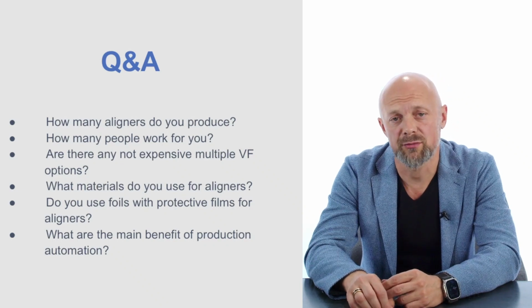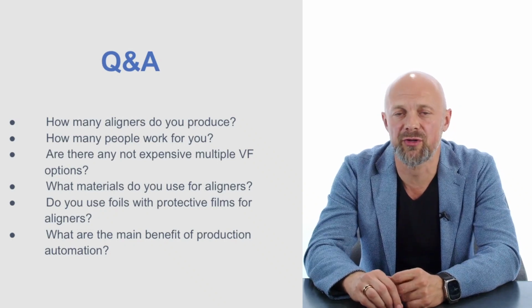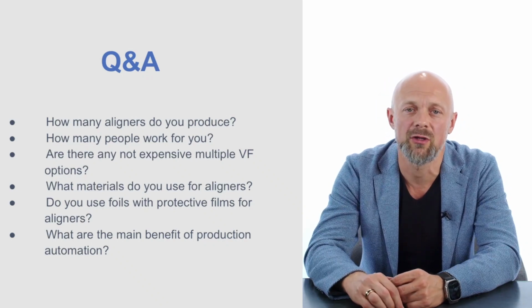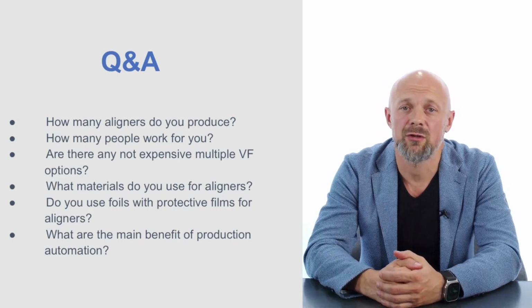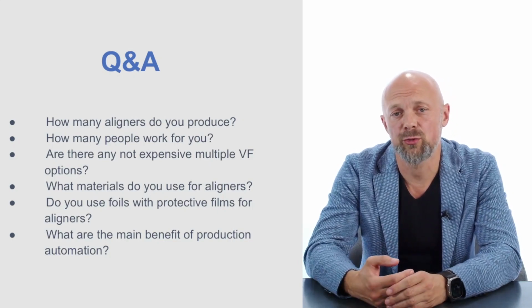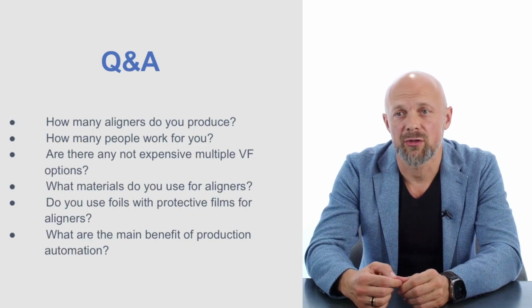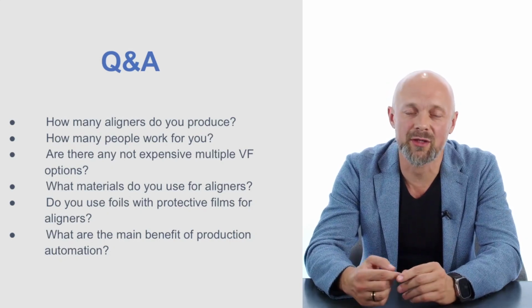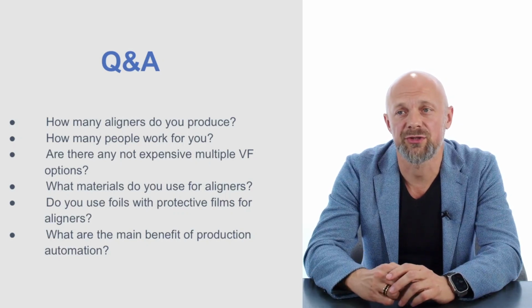So let's say it's cheaper than Zendura, but the quality is not so perfect as Zendura. The flexibility is slightly less than Zendura, and the stiffness is also less than Zendura. Unfortunately, in my region, I cannot use Zendura because Zendura is not available in my region. Only one analog is available. This is CA Pro. That's why we use CA Pro.